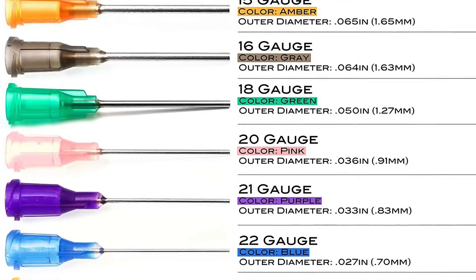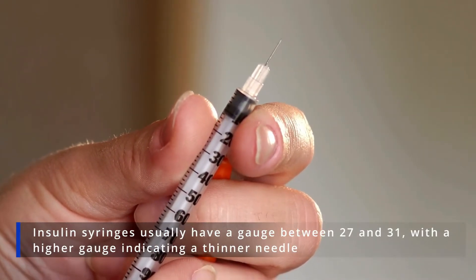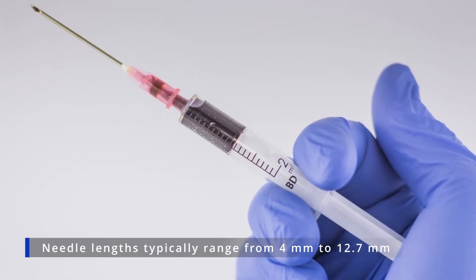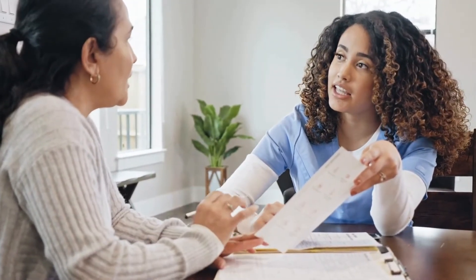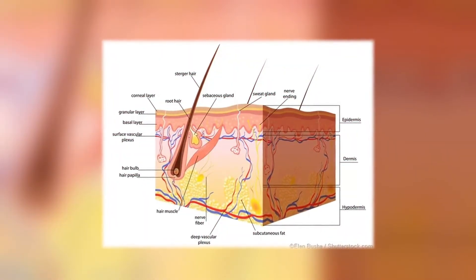The gauge is the thickness of the needle. Insulin syringes usually have a gauge between 27 and 31, with a higher gauge indicating a thinner needle. Needle lengths typically range from 4 millimetres to 12.7 millimetres. Your healthcare provider can guide you on the suitable gauge and length based on various individual factors, such as the thickness of your subcutaneous fat tissue.